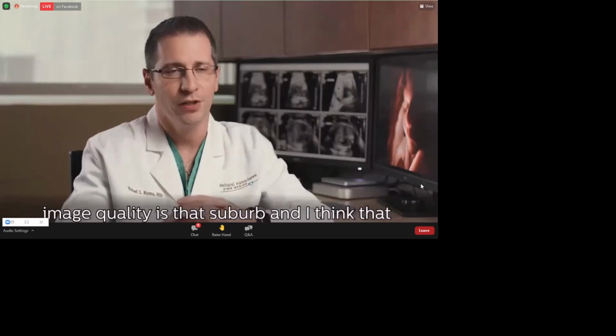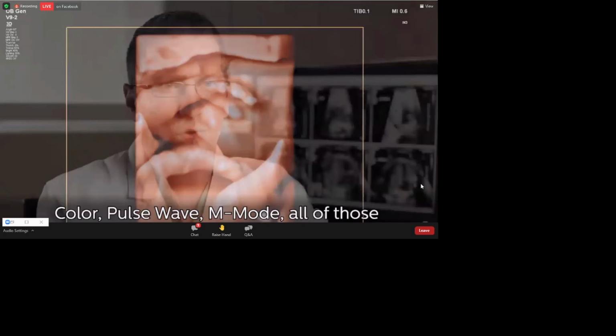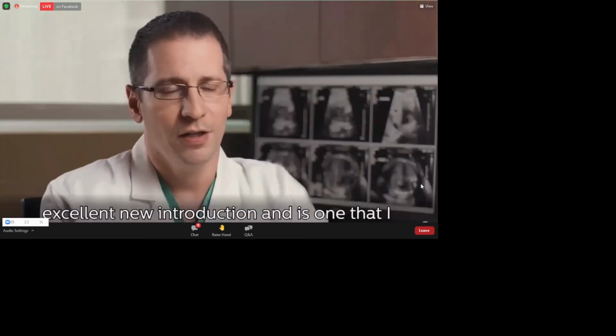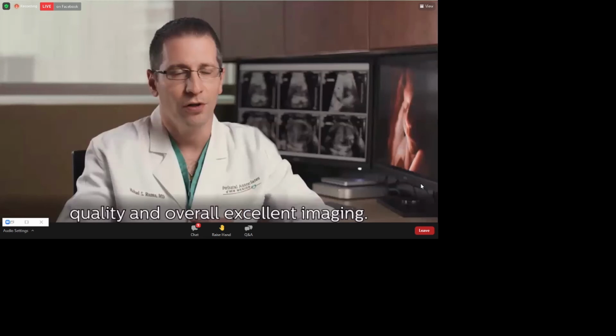And I think that you'll see the 3D imaging is excellent. Using the 3D, it's not only very quick, the 4D acquisition is speedy and very smooth. Color, pulse wave, M mode, all of those have been refined in this probe. In my opinion, the V92 transducer is an excellent new introduction and is one that I think you'll find to provide superior image quality and overall excellent imaging.